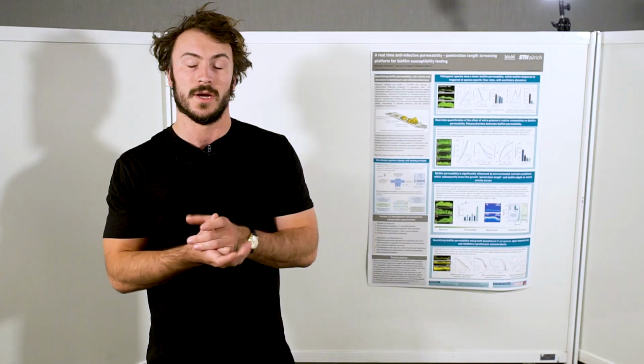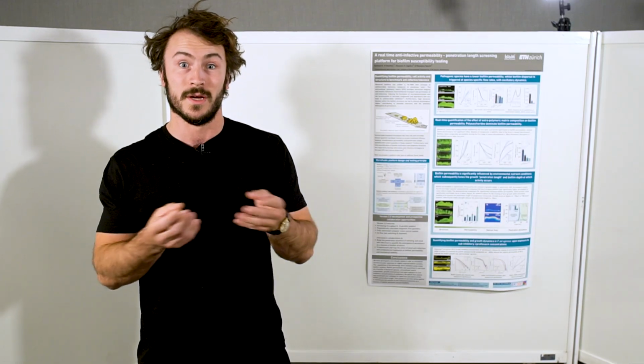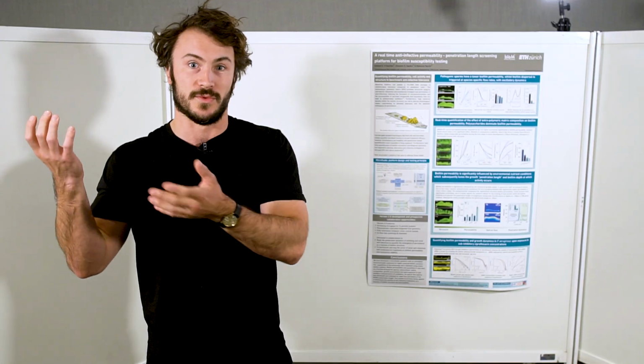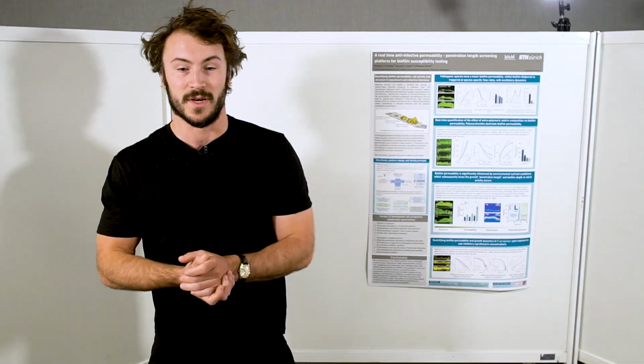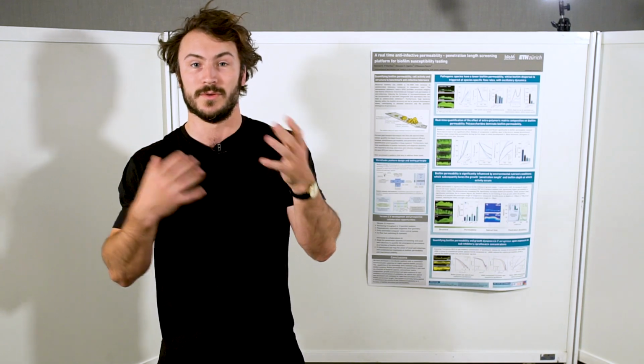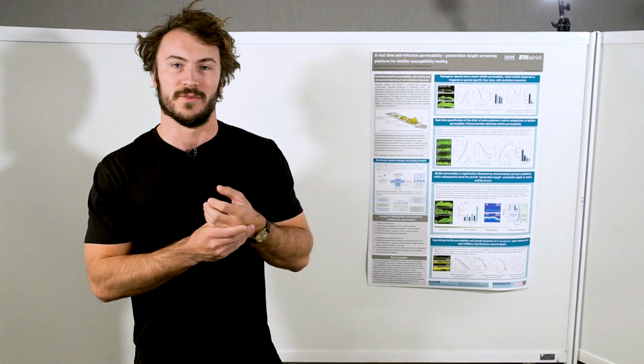And this results in enhanced stability against dynamic shear forces in the local environment. And it also results in changes to cell physiology deep within the biofilm and the formation of self-produced gradients, or gradients produced through the environment. What the platform that we've designed here aims to do is capture these different dynamic processes going on in the biofilm system, quantify them using computer vision and mechanical testing, and provide more resolved, enhanced data on antimicrobial susceptibility tests against any different type of bacterial biofilm you can imagine.